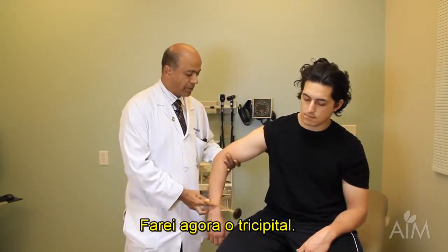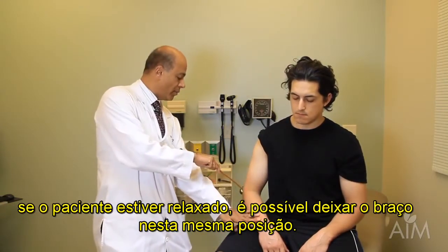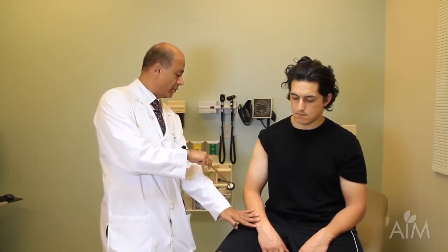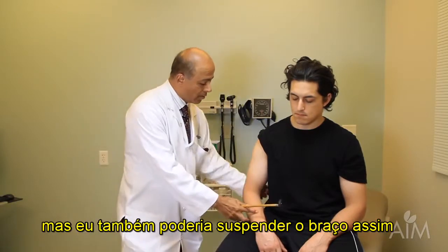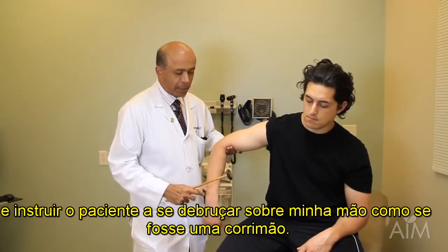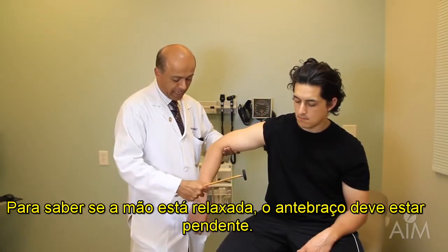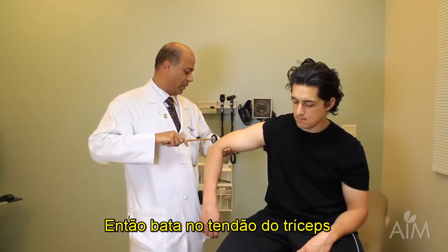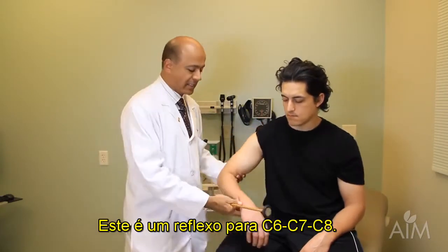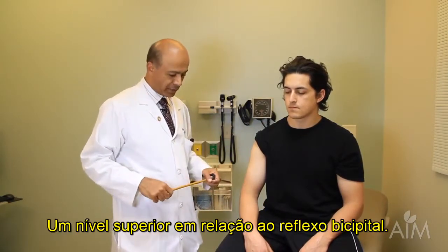I'll now do the triceps, which you could do many ways. If he's relaxed this way, I could just choose to leave his arm in the position it is, and I'm actually getting a good reflex in this fashion, so I probably wouldn't proceed further. But I could also suspend the arm like this, instruct the patient to lean on my hand as though leaning on a railing, and the measure of the hand being relaxed is that the forearm is loose, and then once again strike the triceps tendon, and this is a 6-7-8 reflex, a higher level than the biceps 5-6.